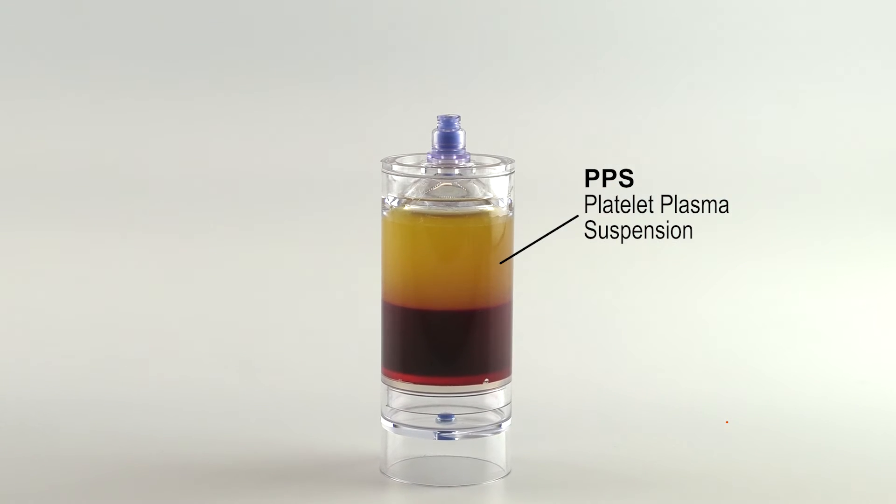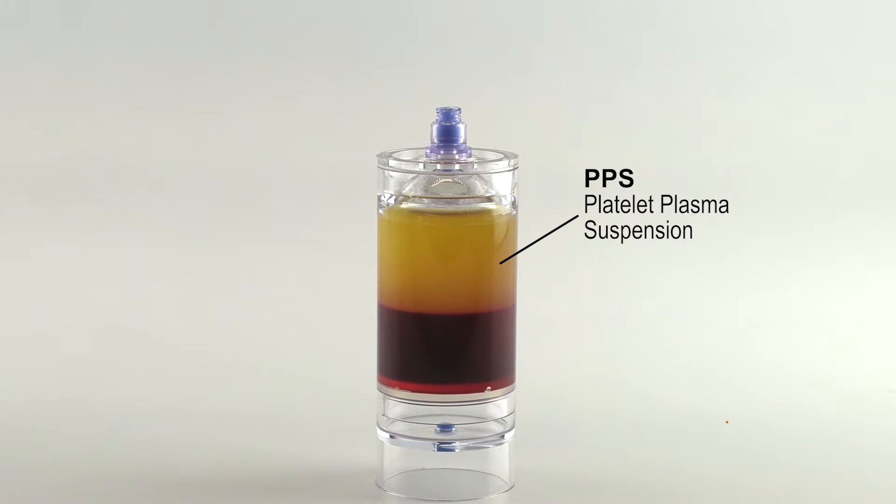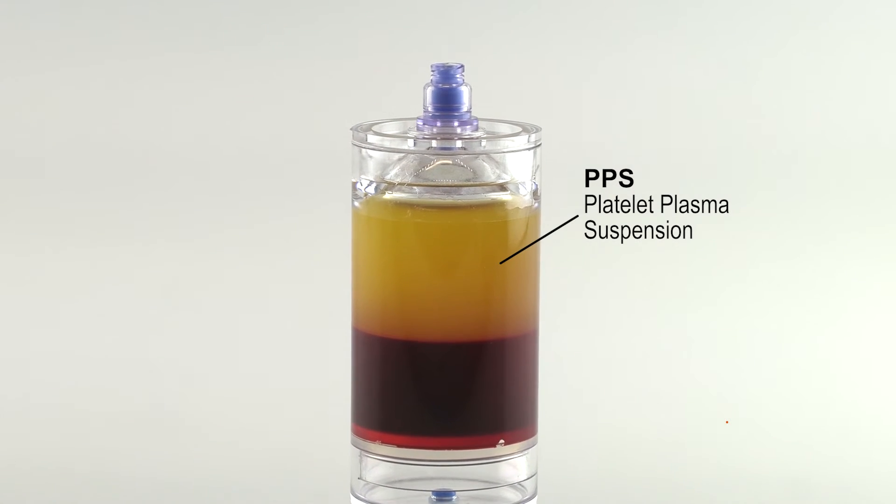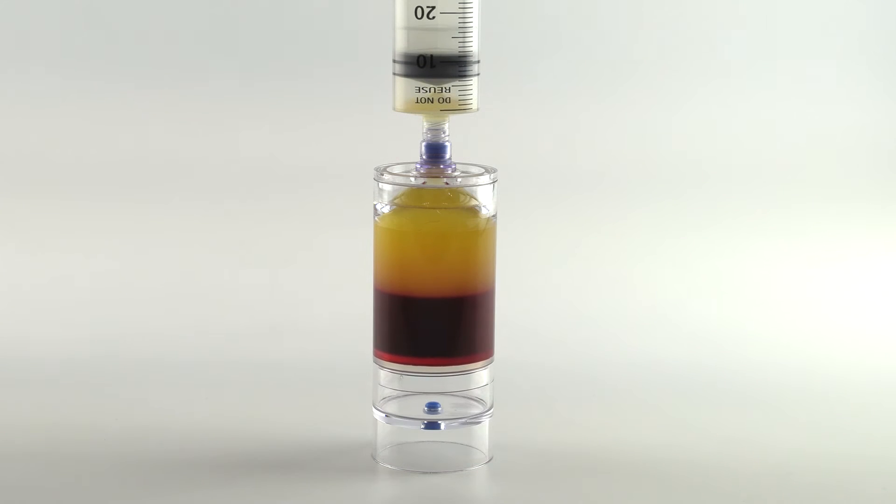After centrifugation, the platelet plasma suspension, or PPS, will be separated above the red blood cell layer. Attach a sterile syringe to the top port and aspirate the platelet plasma suspension.